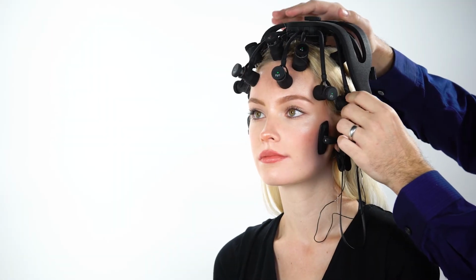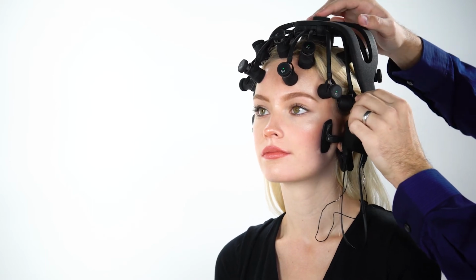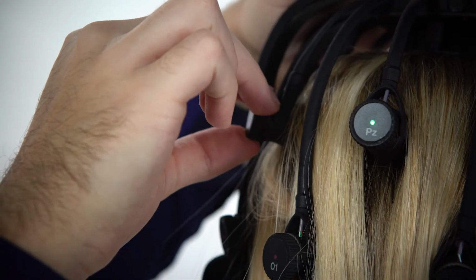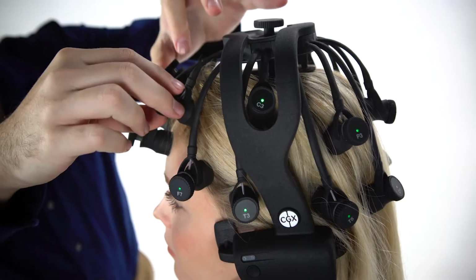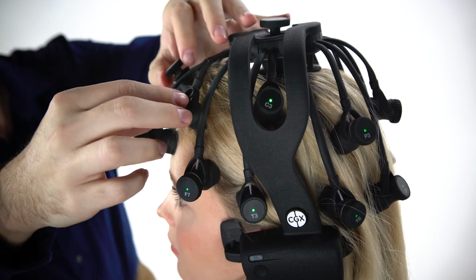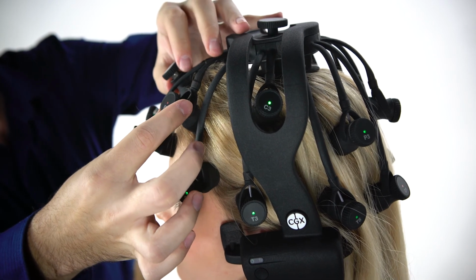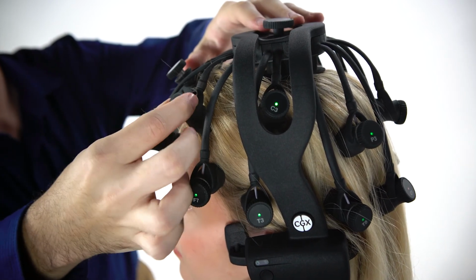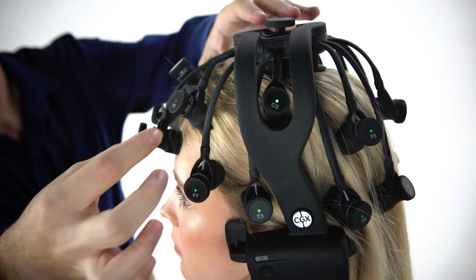For positions other than CZ, lift the pod, moving hair aside. Lower the pod, keeping the sensor aligned to the subject's head. Gently twist the sensor adjustment with a smooth downward pressure. This glides the sensor through the hair. Then release when the light turns green. Avoid lifting the pod when releasing. For all adjustments, keep a hand on the top of the headset to prevent disrupting or moving the system.